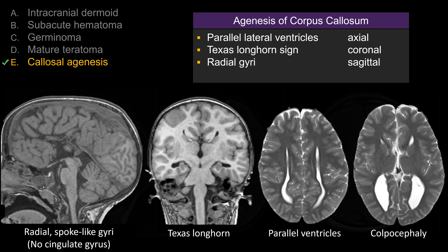This is another example of a classic picture of agenesis of the corpus callosum. On the sagittal view, there is complete absence of the corpus callosum as well as absence of the cingulate gyrus, making this spoke-like radial appearance of the gyri. On the coronal view, again, the Texas longhorn sign — the upturn of the frontal horn of the lateral ventricle with absence of the corpus callosum — parallel appearance and widening of the body of the lateral ventricle, and the classic dilatation of the atrium and the occipital horn of the lateral ventricle, referred to as colpocephaly.